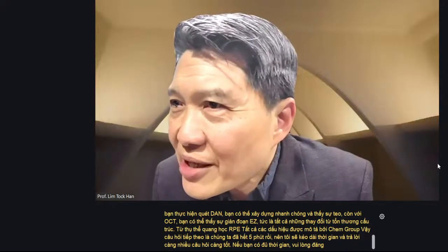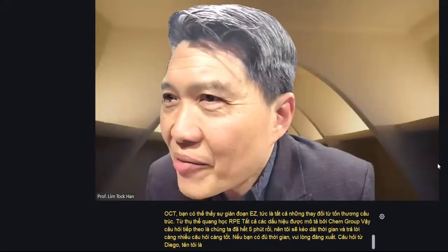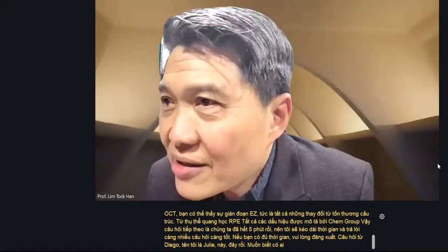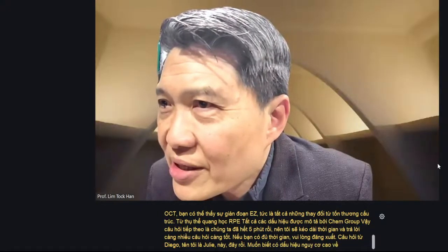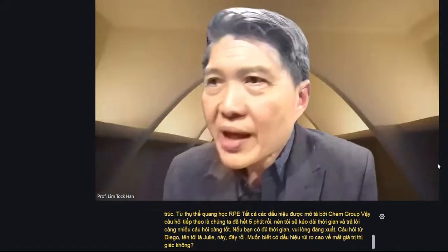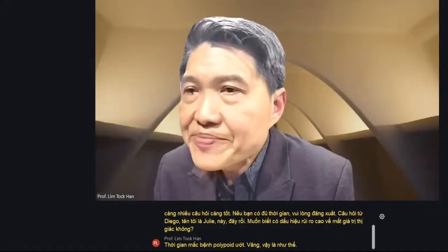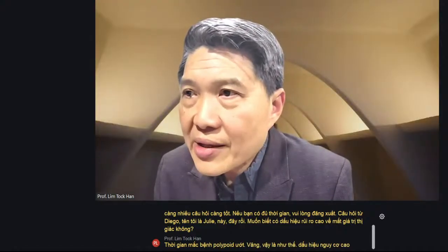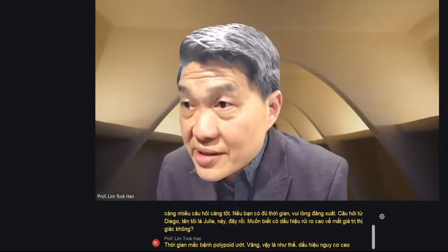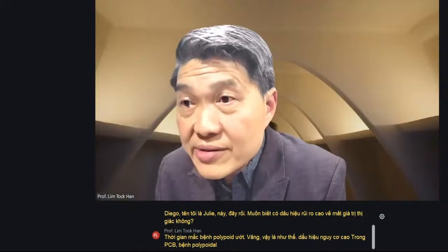Question from Diego from Chile. Hi, Diego. He wants to know if there are high risk signs of visual acuity loss over time in wet and polypoidal disease. So in terms of high risk signs, in PCV, polypoidal disease, it is actually quite difficult to predict.